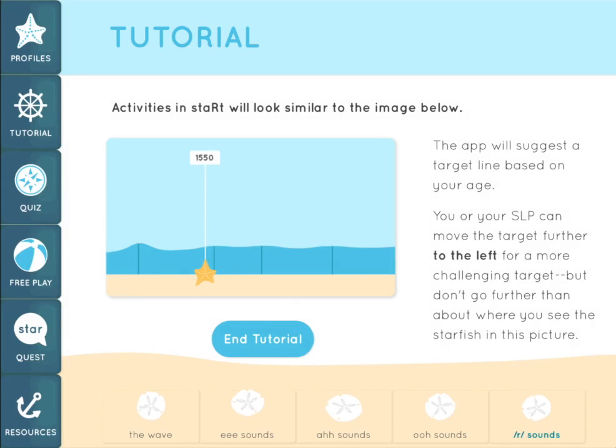When you use the START app to practice with your client, you'll see something similar to this image. The target line appears as an adjustable starfish slider. When you create a user profile, the app will suggest a target location for the line based on information you entered about your client's age, height, and sex. It's okay to move the slider further to the left for a more challenging target. However, you don't want to go further than about where you see the starfish in this picture.